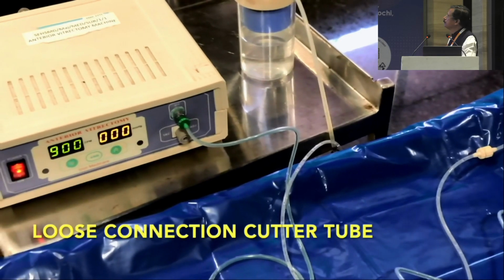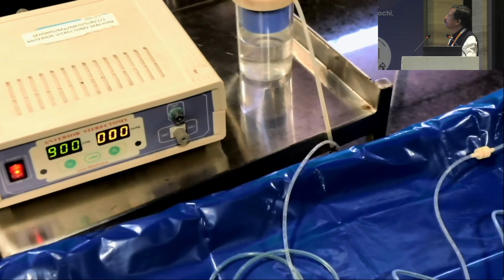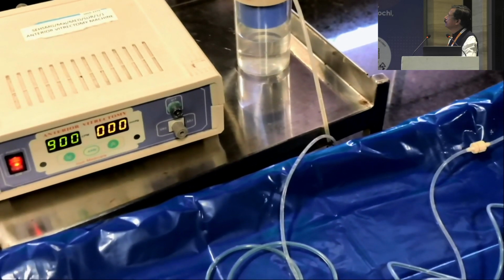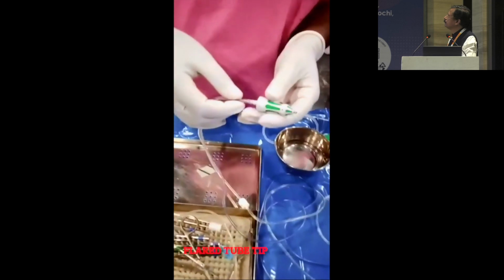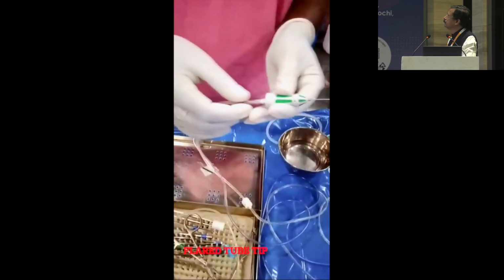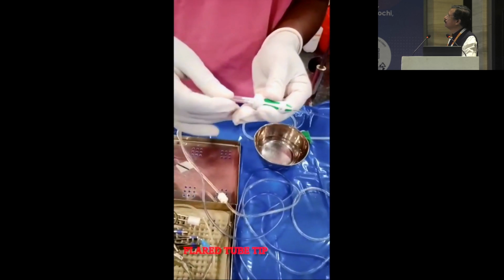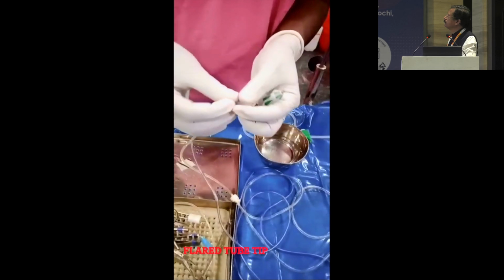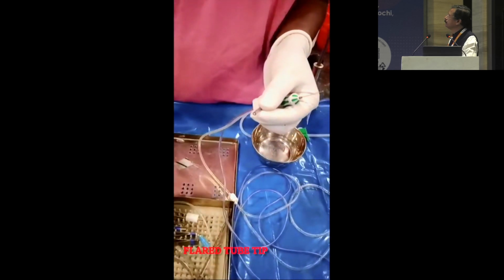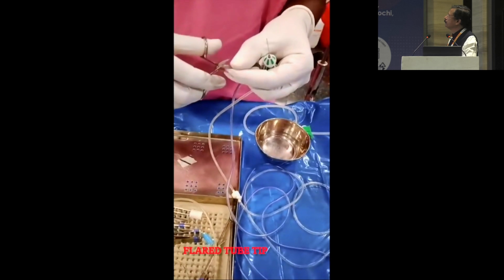If you connect the vitrectomy tubes loosely, when you press on the foot pedal, it will suddenly come off. Sometimes the vacuum won't generate. When you look at the vitrector, the tubing looks fixed, but the tip may be flared up.